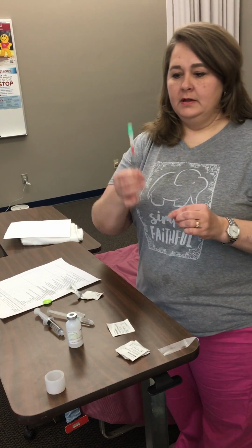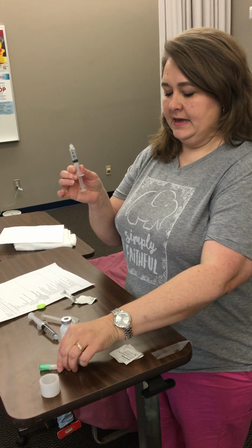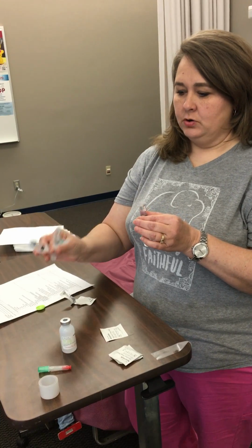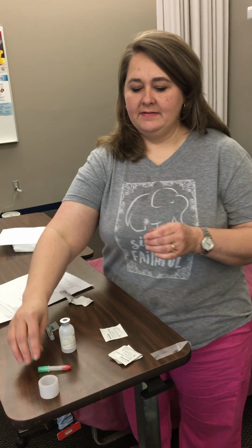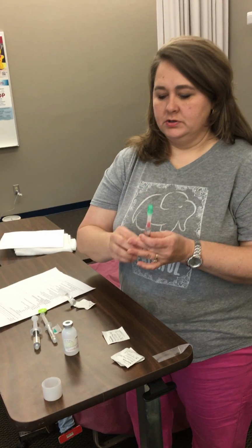And at this time, I want to go ahead and label this medication with the patient's name and the medication name on here. And for demonstration purposes, I do not have caps on my syringes, you'll see, but in the hospital or in your checkoff, you need to make sure that you have a cap on the end of your syringe at all times, because we want to keep that part sterile.